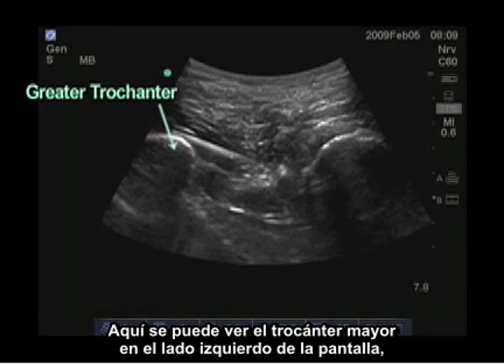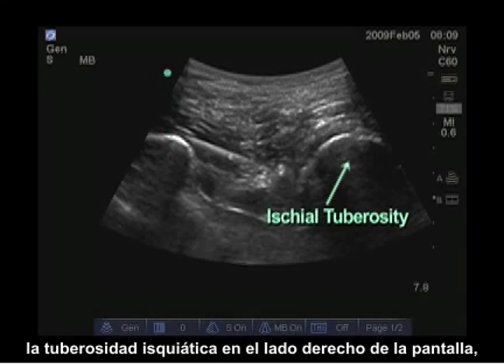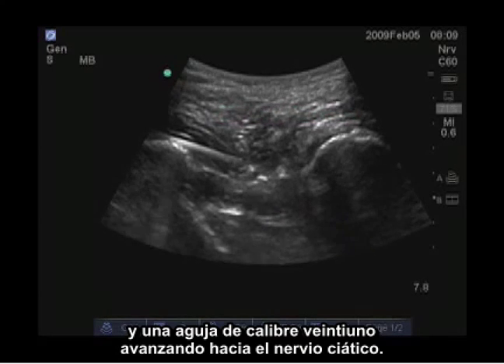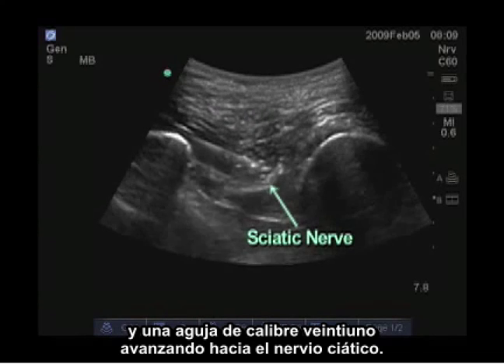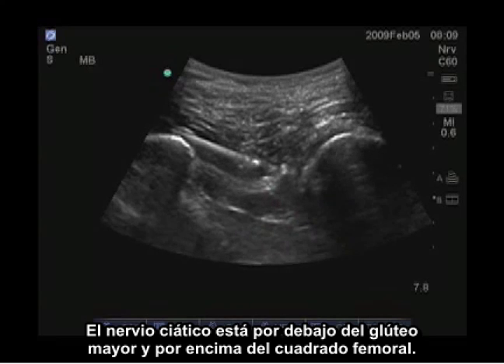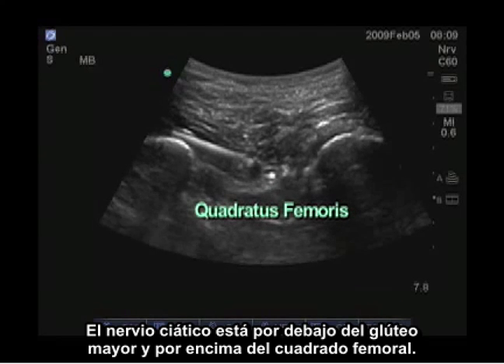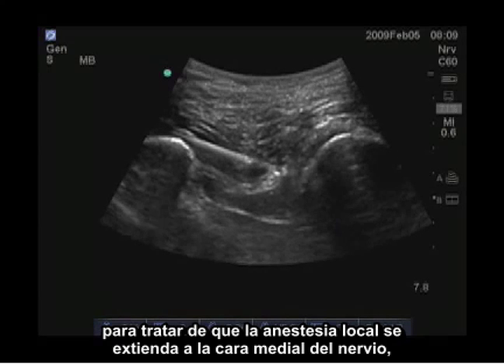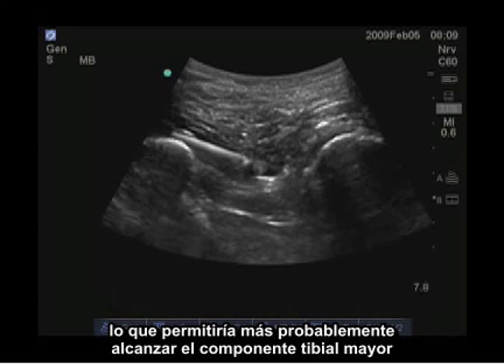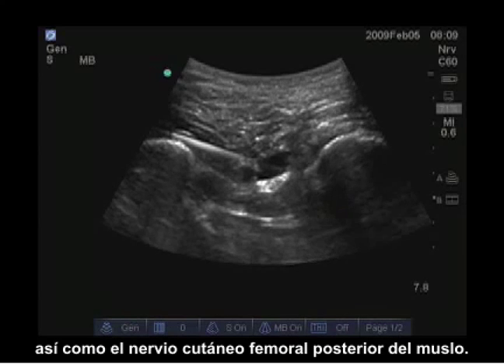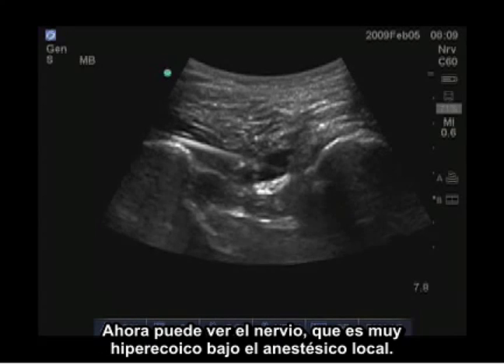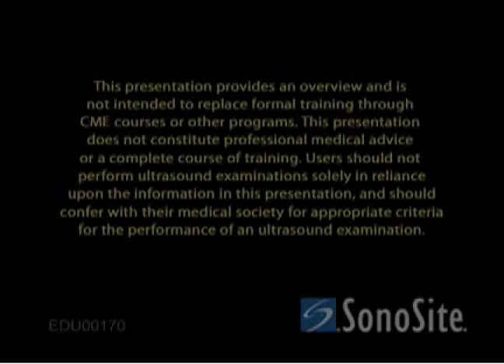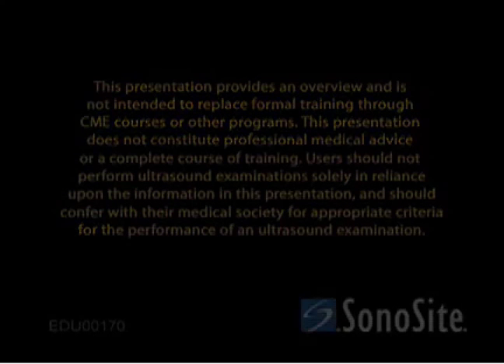Here you can see the greater trochanter on the left side of the screen, the ischial tuberosity on the right side of the screen, the gluteus maximus superficial, and a 21 gauge needle advancing to the sciatic nerve. The sciatic nerve is below the gluteus maximus and above the quadratus femoris. The needle is advancing above the sciatic nerve to attempt to get local anesthetic to spread to the medial side of the nerve, which is more likely to reach the larger tibial component as well as the posterior femoral cutaneous nerve of the thigh. Now you can see the nerve, which is very hyperechoic, below the local anesthetic. The sciatic nerve is a bit more likely to be in the middle of the field.